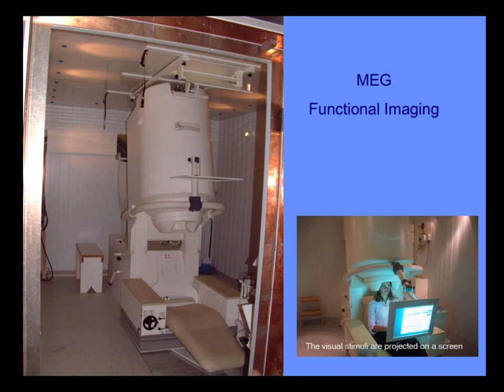But we have a 3-layer mu metal shielded room, which helps. The set of sensors for the head are in here, where the head goes. But up in here, there are 39 additional channels that sample the ambient field and subtract that out. So that's what gives us our ability to operate in this place, very noise immune. All the signals for stimulation have to be projected in from the outside, much like in fMRI, because we're trying to keep all of the electrical noise outside of the room.